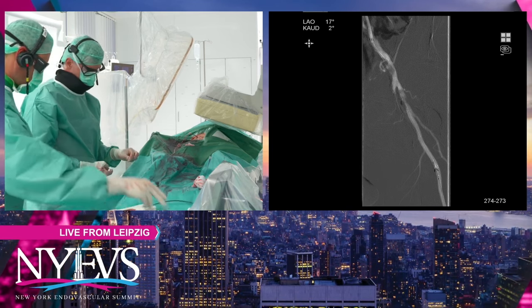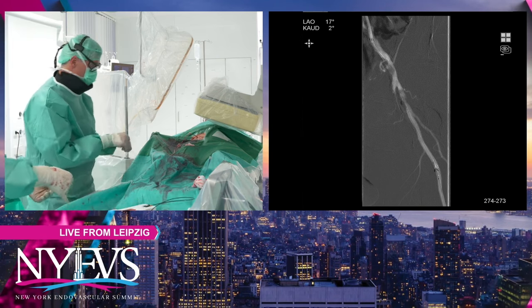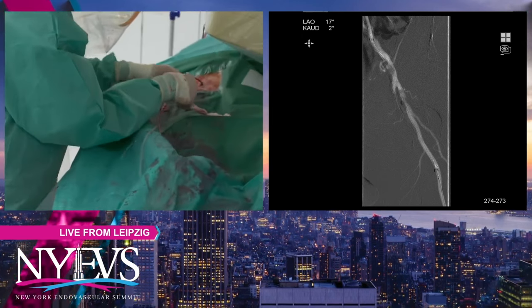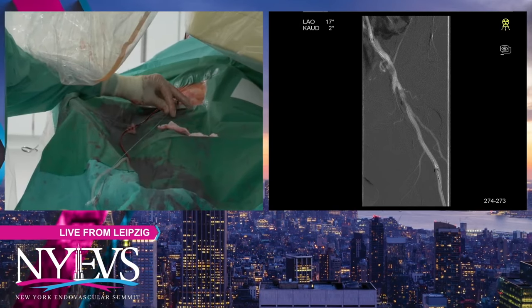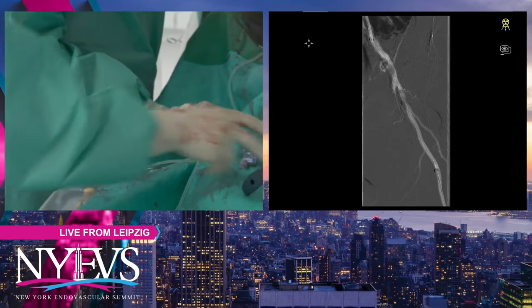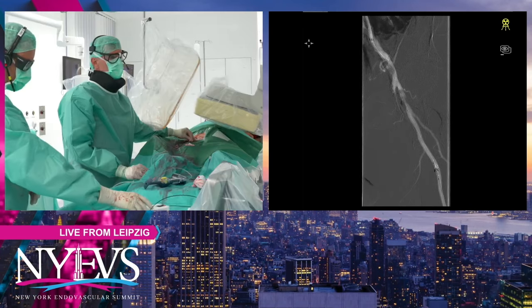So you go blades down, blades up, and start cleaning as you go, so you don't create a huge debris field as you come out the other side of a CTO. But this is not just filter accumulation of debris; it's also fairly active vasospasm and humoral factors sent downstream to create slow flow.